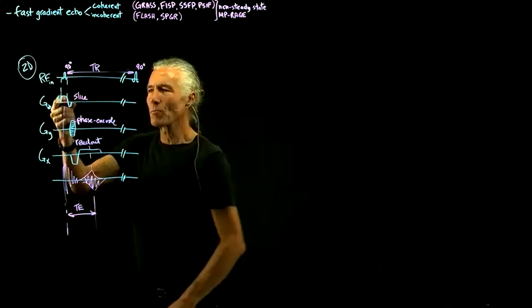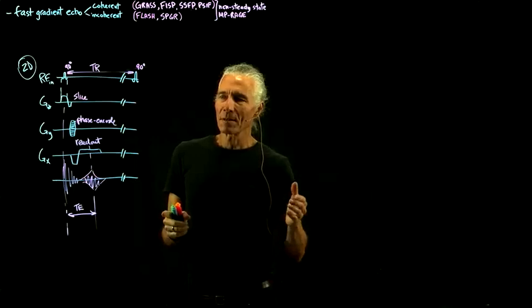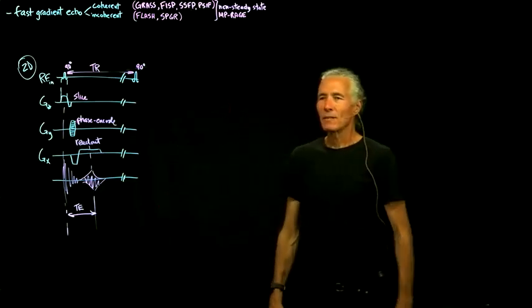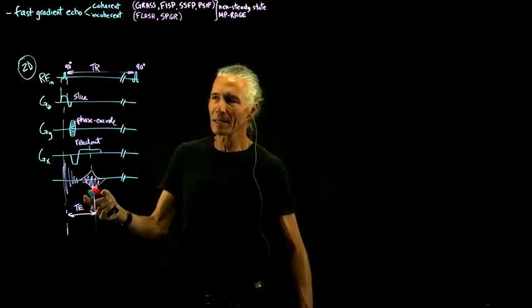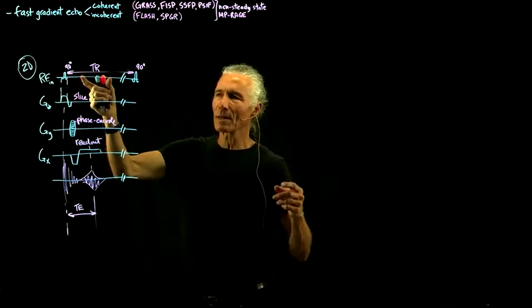So you could do one slice here and then do the other slices, but even so, if you're waiting a second or two, it's still going to be a lot of dead time. Depending on how you set up your TR and TE, you can make this T1 weighted if you use a TR that's not too long, so that you get some T1 contrast.